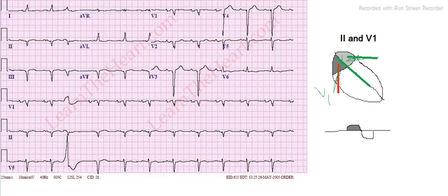Now we will look at lead 2 here. I will bring a circle here. So you see here this is lead 2, isn't it? In this lead 2 you see the P wave morphology is a double peaked P wave. Did you see that here?